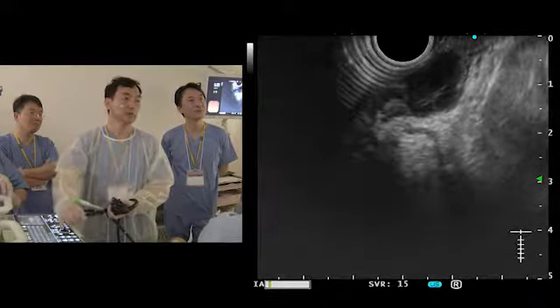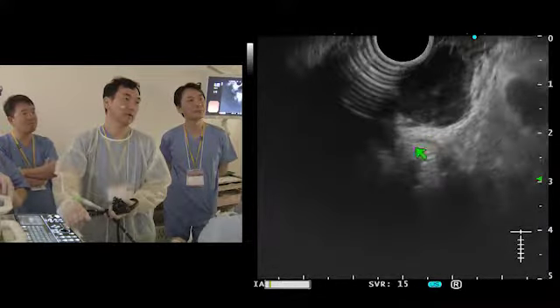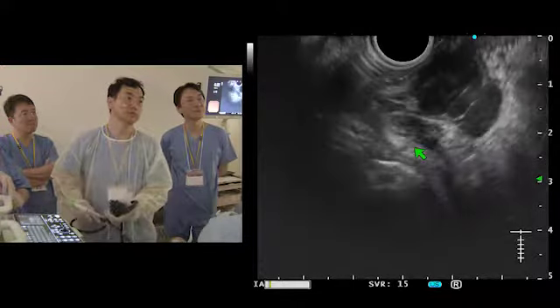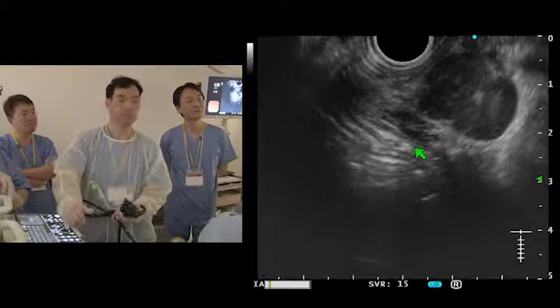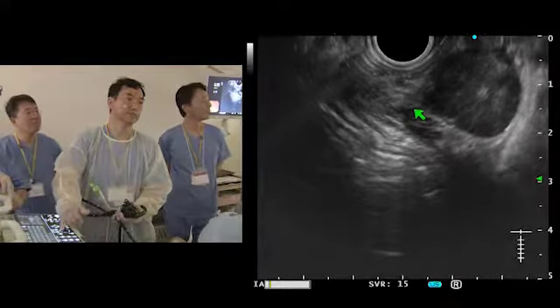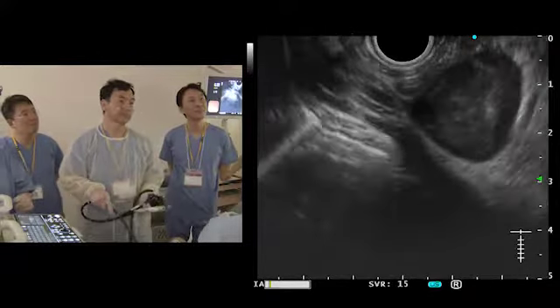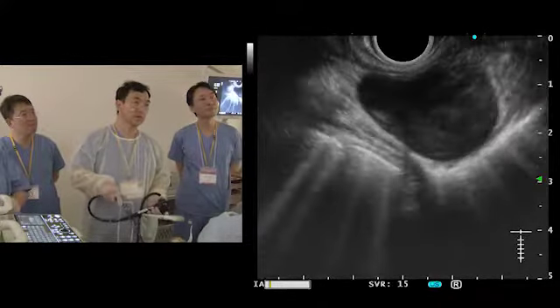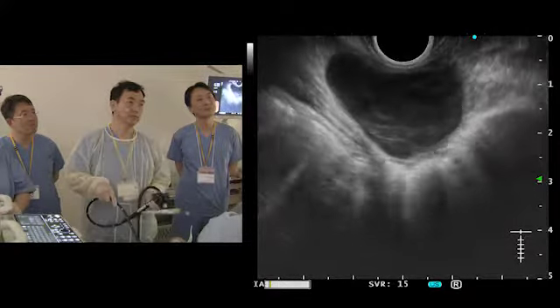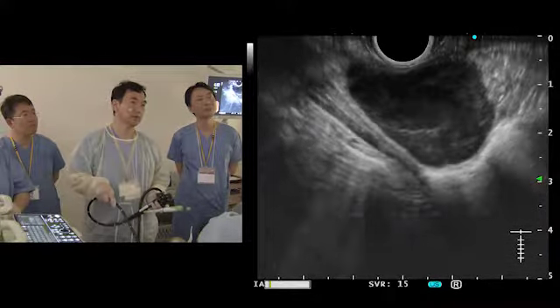Yes, that's great. So just to give you one more piece of information, this is the diaphragm going close to it. You see this striated muscle of the diaphragm. So it's really low in the esophagus, and we can approach from the abdominal side, so laparoscopically we can approach it. Now, if this is supposed to be a GIST, would chemotherapy with Gleevec to shrink the tumor help?